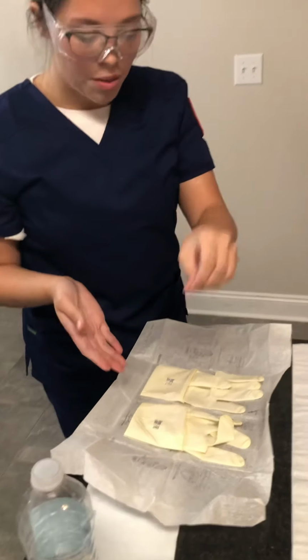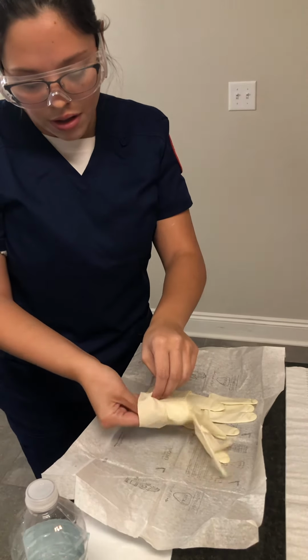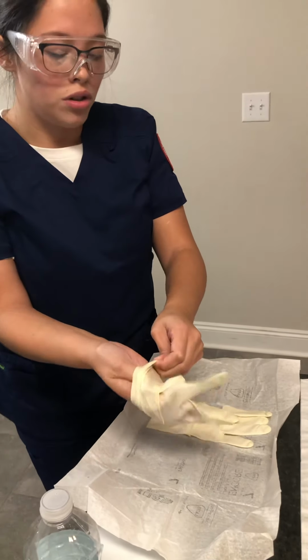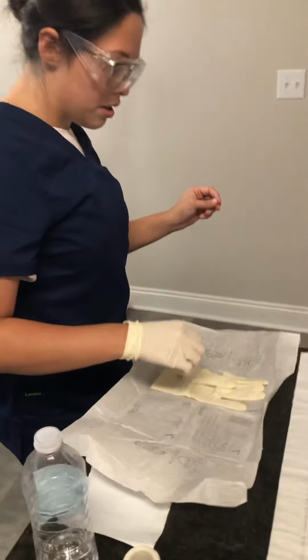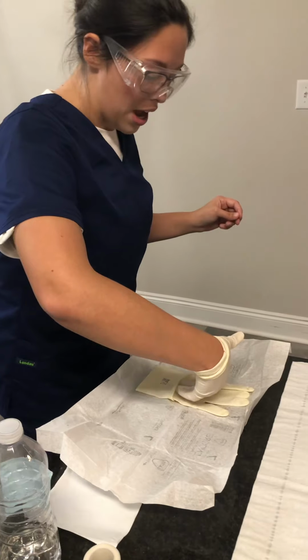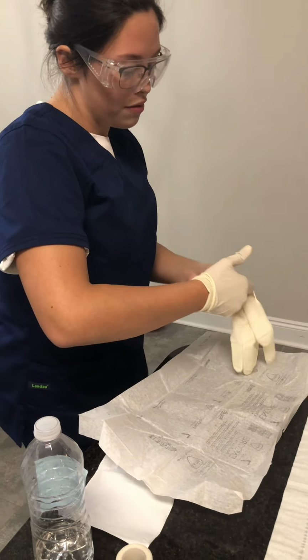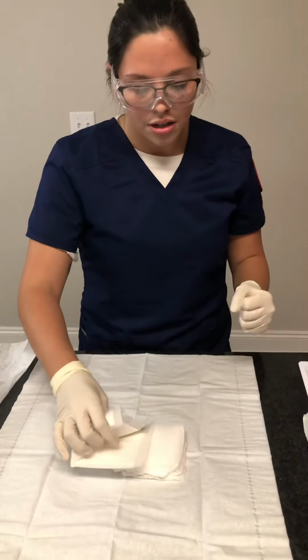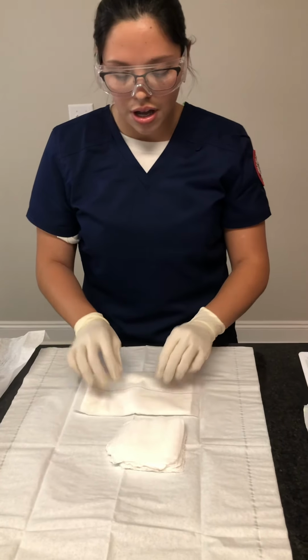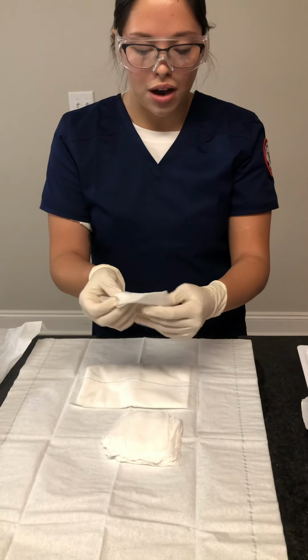I will take my non-dominant hand and grab the outer cuff to place the glove onto my hand. And I will take, with my thumb facing outward, go on the inner cuff and apply this glove. I will then organize my equipment. I will place 5 pieces of gauze in the saline without touching the outer edges of the tray.